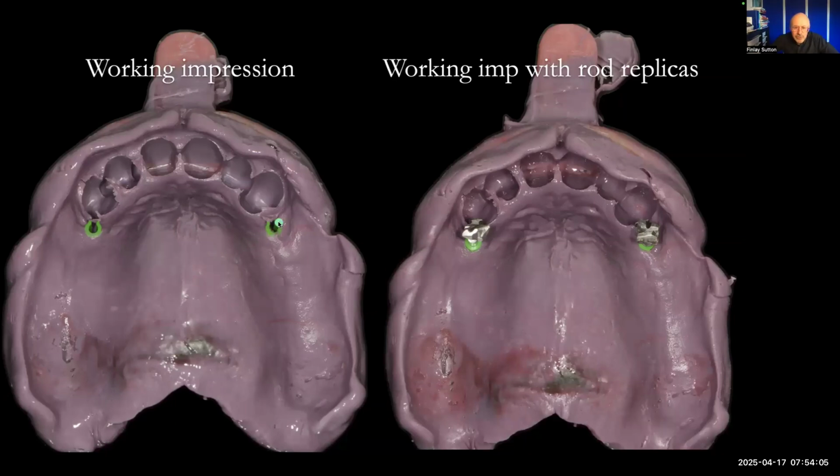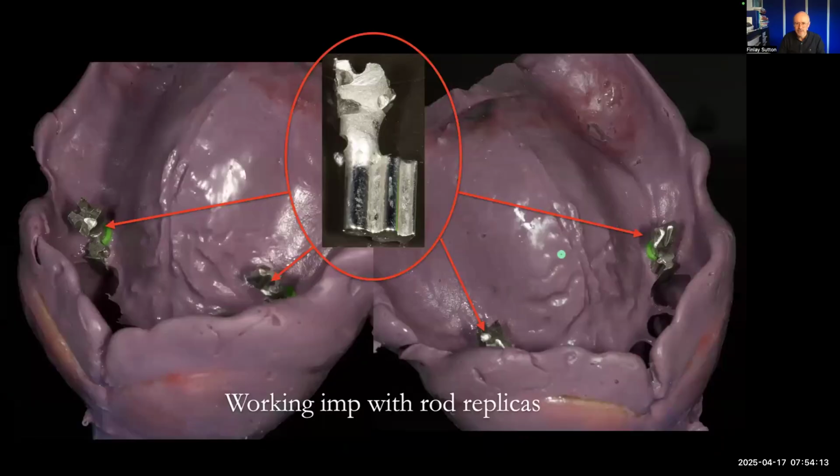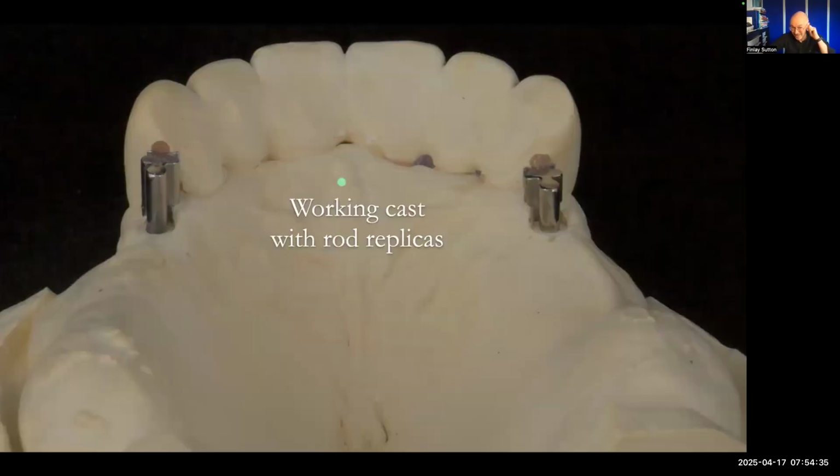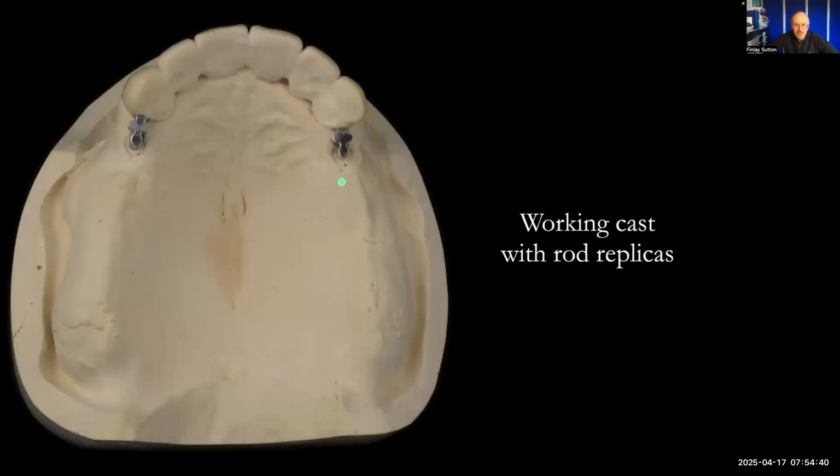And then into those impression pickups, those cast chrome patrices get pushed in. You can see here, we've got two of these that Chris has made. I just push those into those impression pickups, and then the working cast is poured. And so we've got a great working model to work with just there. So we can make the denture on that, and it's just going to fit onto those slots beautifully, just like that.